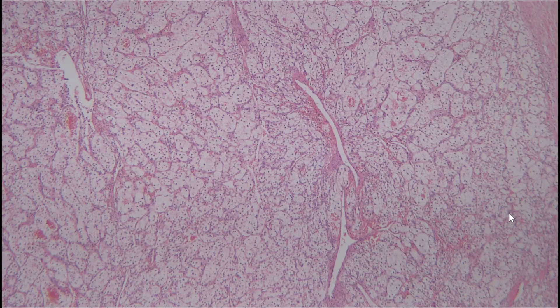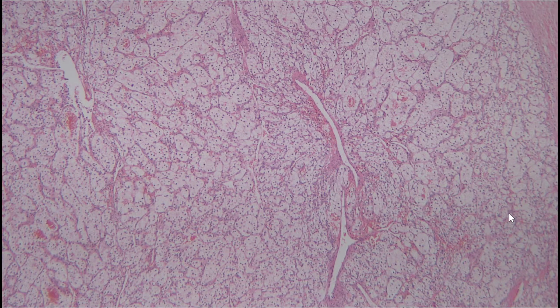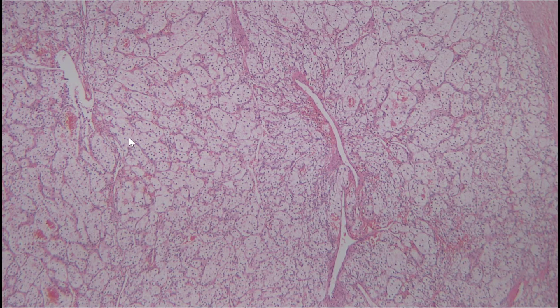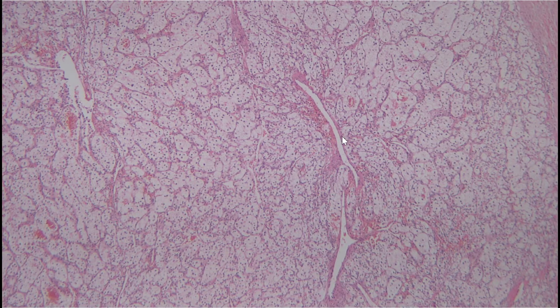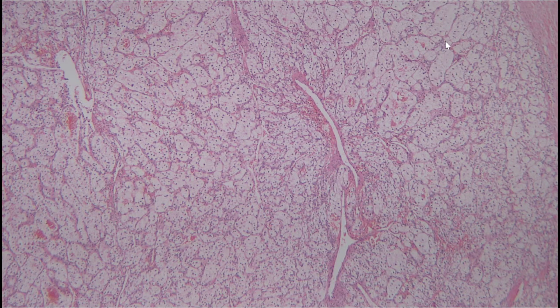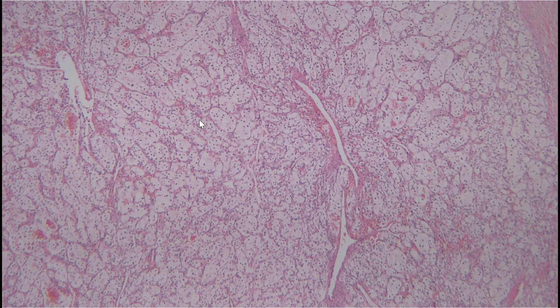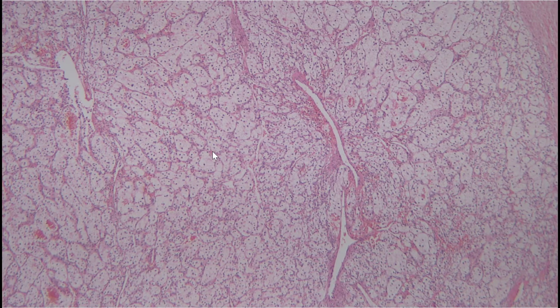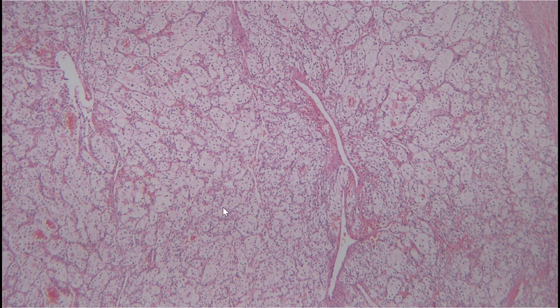Here is the second case. From low-power magnification it has a similar nested or loosely formed nested appearance set within a very hypervascular background with venous-sized blood vessels. Most prominent are delicate arborizing chicken-wire microvasculature. Even from this magnification, clear cell change within the cells can be appreciated.